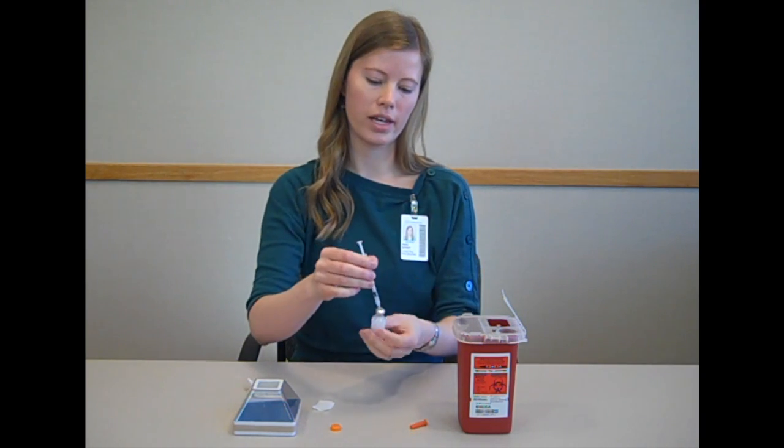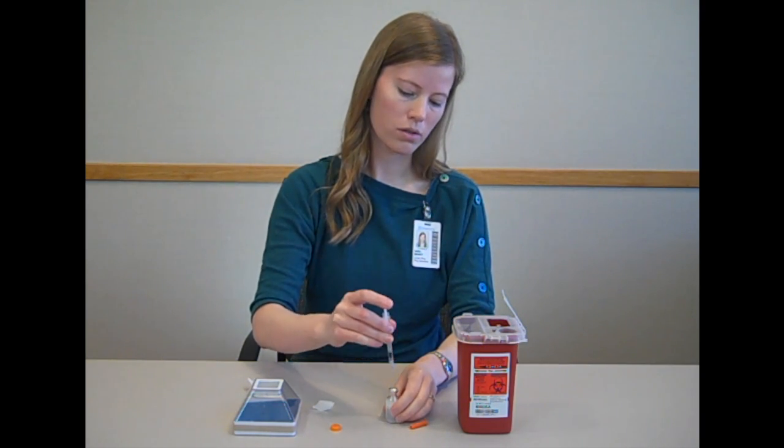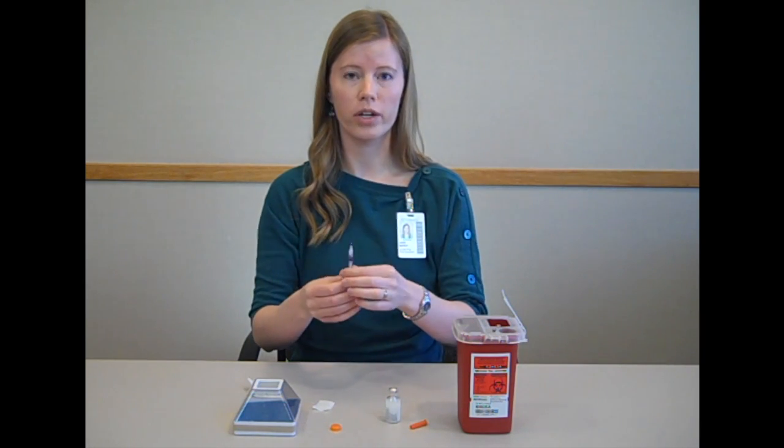Then turn the whole thing over again and pull the needle out. At this point, you're ready to inject.